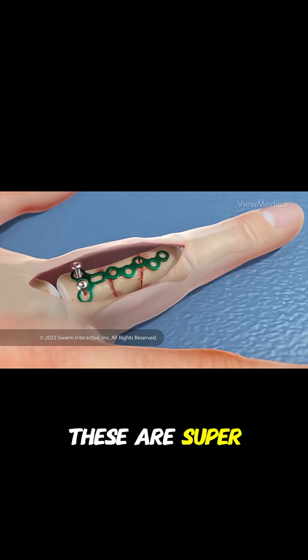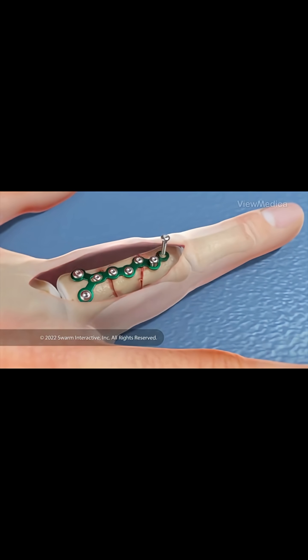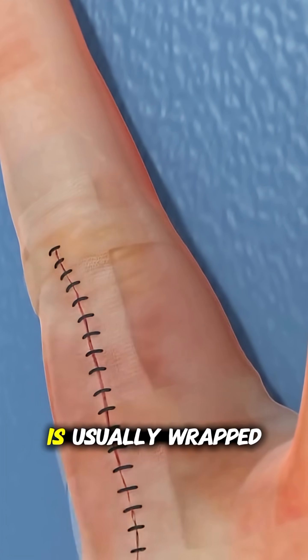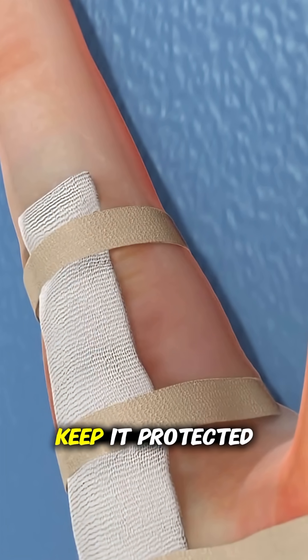These are super small, almost like miniature hardware. Once everything is secure, the incision is closed with stitches and the finger is usually wrapped or splinted to keep it protected.